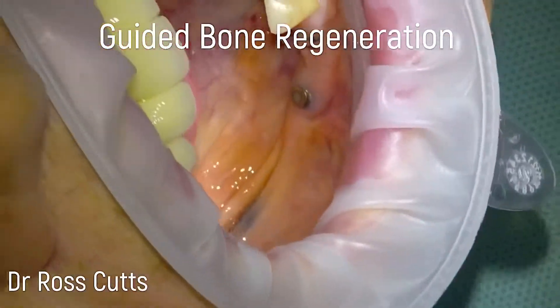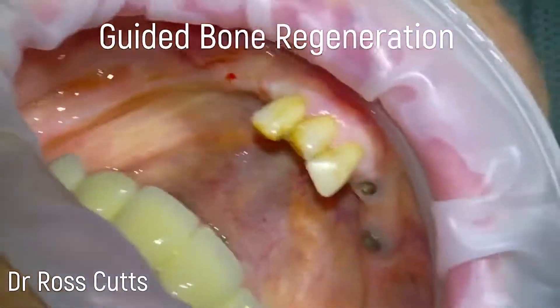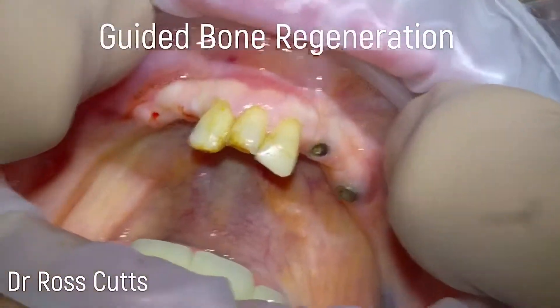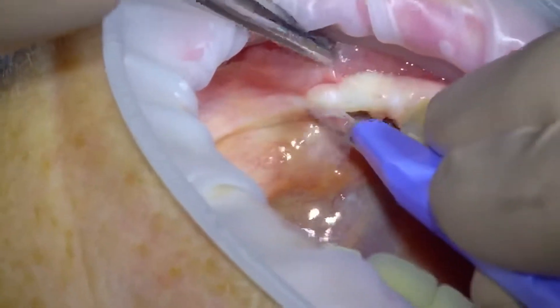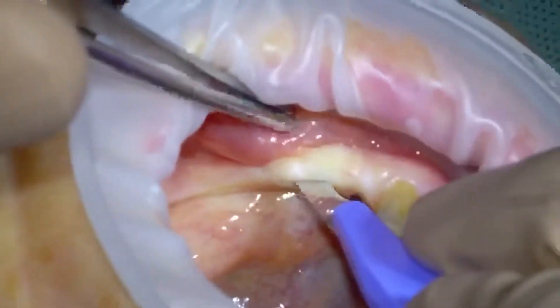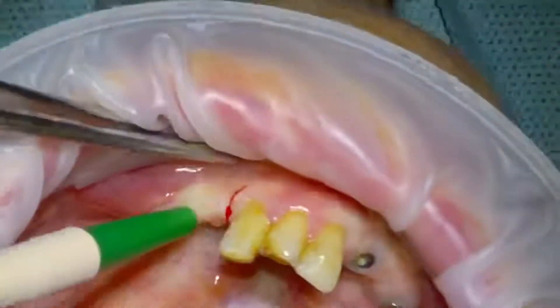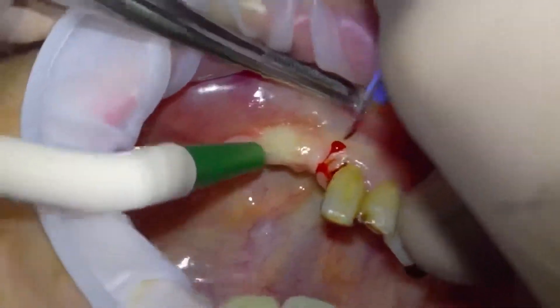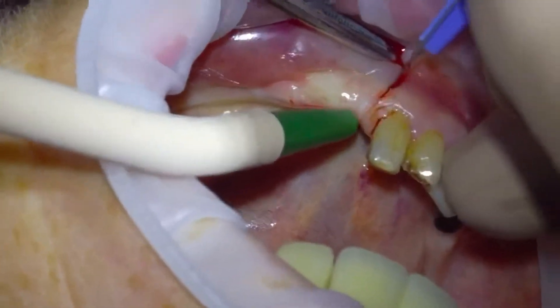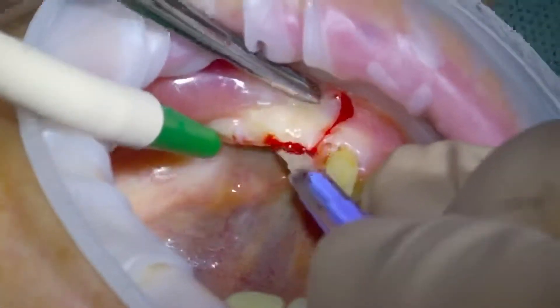Hi, my name is Dr. Ross Cutts and you're watching my video on guided bone regeneration. This is a video post-lockdown — there are a couple of implants I've placed on the lower right-hand side pre-lockdown. On the left-hand side we've got to rebuild the width of the jaw bone; we've got adequate height but the CT scan revealed inadequate width.